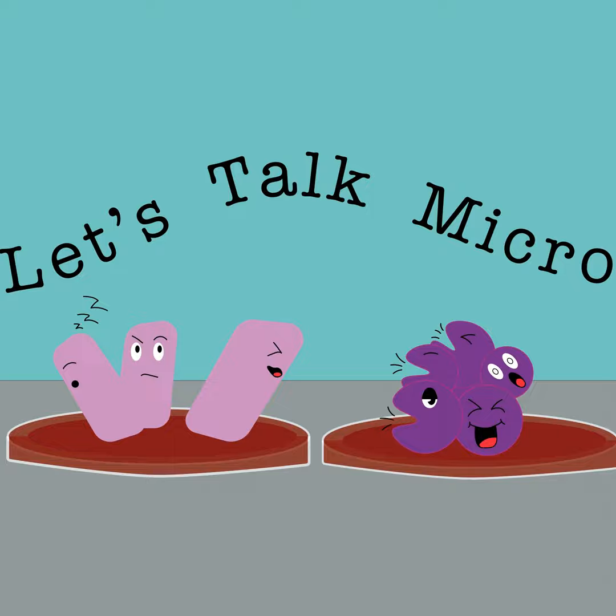So keep in mind, like I like to say, these organisms do not go to school. So you can have some growth. They're selective for Neisseria gonorrhea and meningitidis, but you can have other organisms grow to a lesser extent, of course. And one thing, as I was teaching, I saw that Moraxella catarrhalis actually grows well.